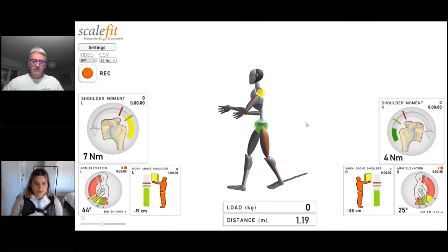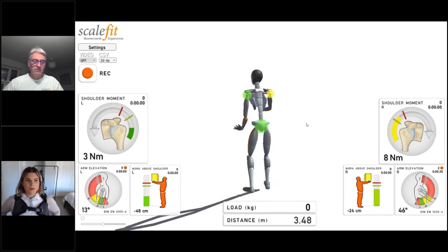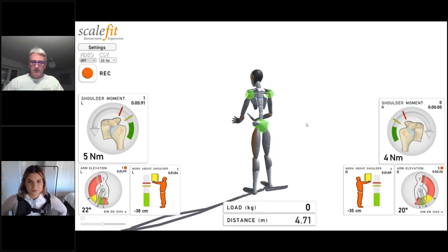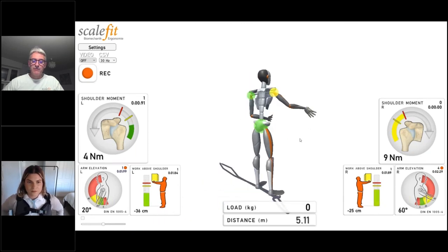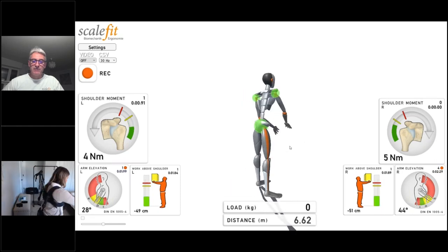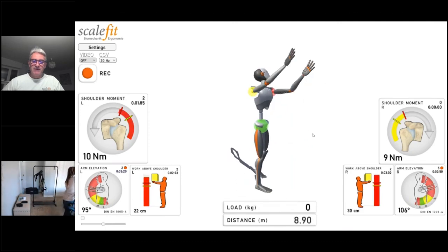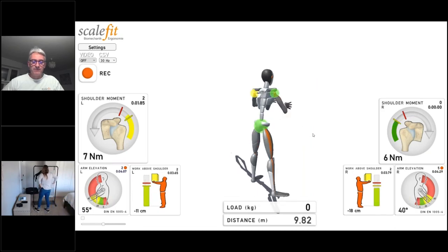Okay, so as I said, we had implemented both the shoulder supporting one and the back supporting one. I will at least start, as time is flying, with the shoulder one. And obviously you can see a task performed by a worker. To explain, he has to get some clothes from a delivering system, pack it, and put it in a box.